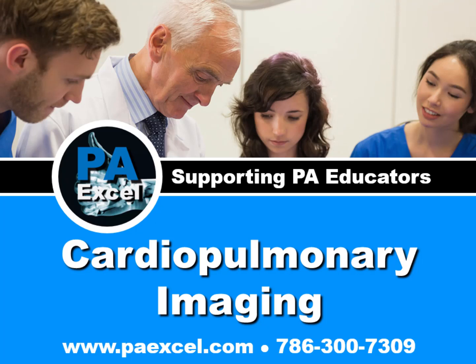Hi everybody, we're going to talk about cardiopulmonary imaging. Mostly we'll be talking about chest x-ray. We'll touch a little bit on CAT scan. So let's look forward to what we'll be covering today in your objectives.